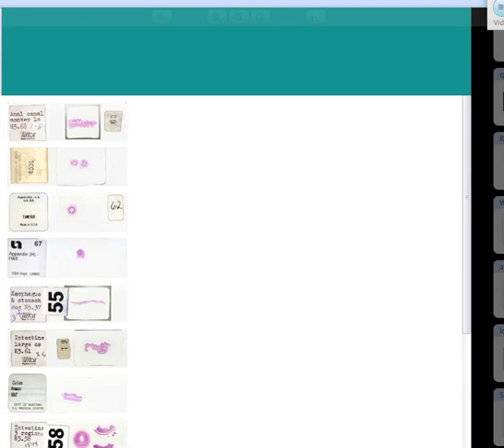What we're going to do is move down to the next letter of the alphabet, and it would be the next alphabetical case in your slide box, which is AACR 5928. And I'm not going to tell you what it is because you should be able to recognize most of these. AACR, oh my God, and don't you dare tell me we can't find that one either.